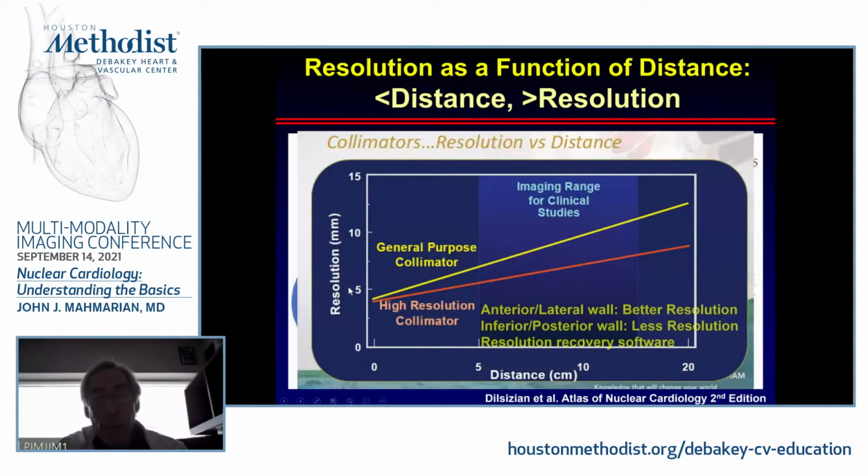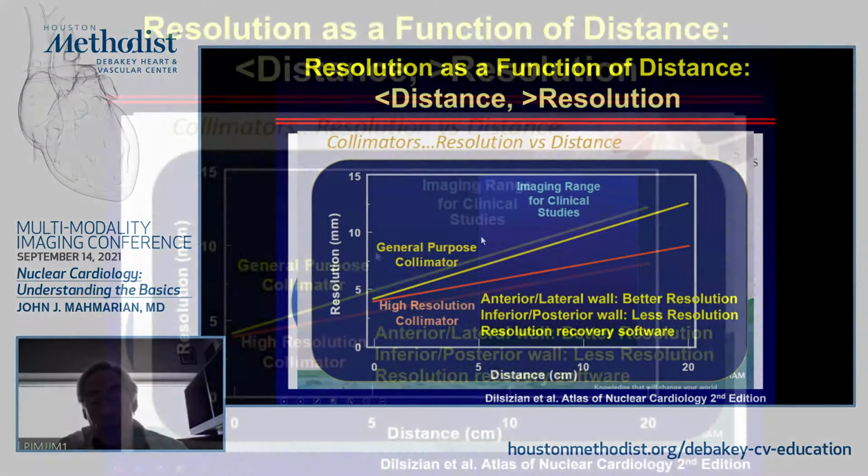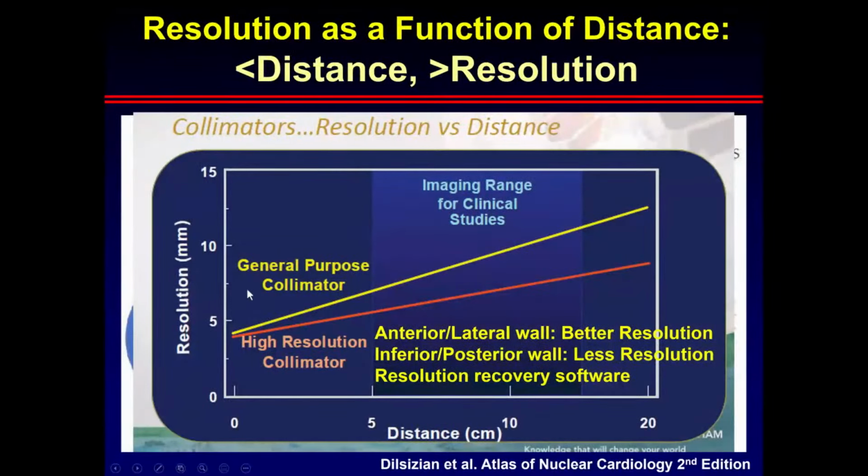The other thing to keep in mind is that not only, as we said, with low resolution collimators, as you get further away, the resolution gets even worse as compared to high resolution collimators.